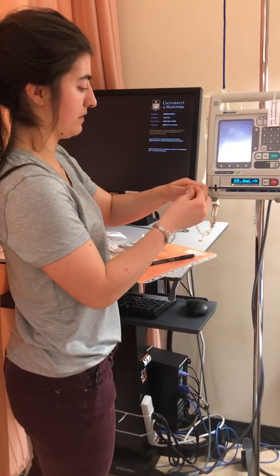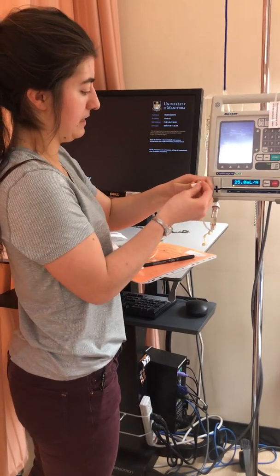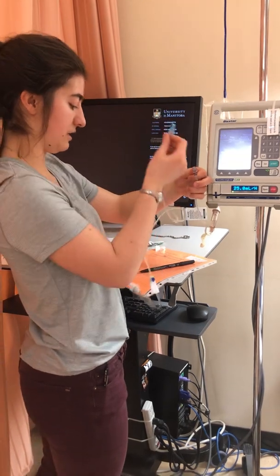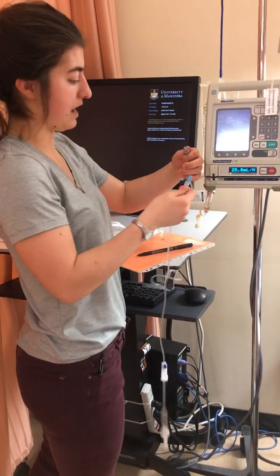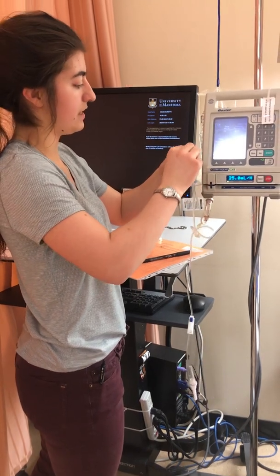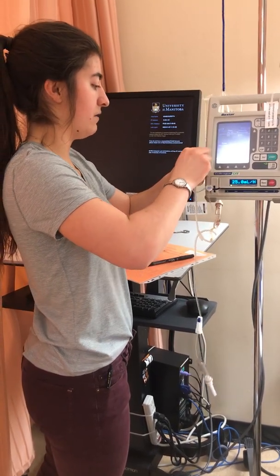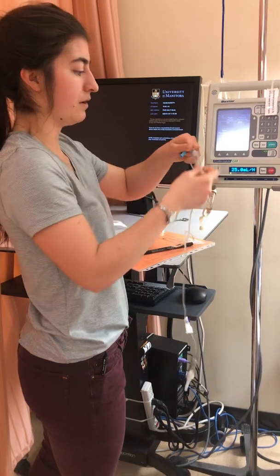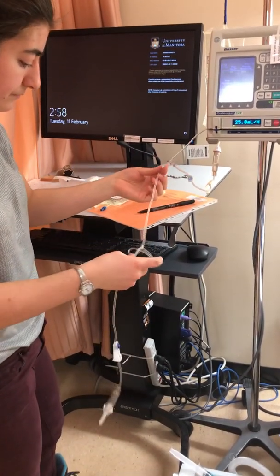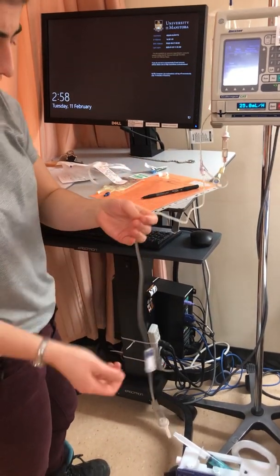We're going to let this guy get clean for 30 seconds, dry for 15, making sure that no breaks in sterility are happening here. For demo purposes, I'm not trying to keep the line, I'm just trying to make sure I have this. It's not being used right now. So, this is good. I'm going to throw these away. They're no longer sterile. And I'm going to back prime my line.